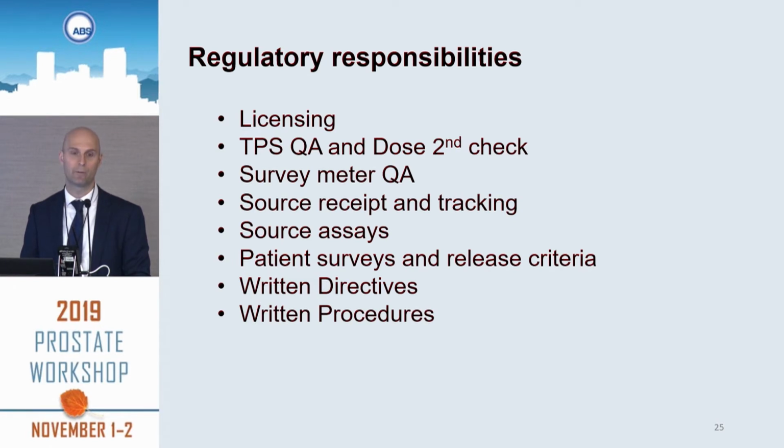You'll be responsible for having a survey meter that has been calibrated, and a process for receiving sources and tracking those sources, and the source assays. If you choose to do an assay, it is recommended by AAPM. There are requirements for what the technology specifications must meet, patient surveys and release criteria, and then of course written directives, what should be documented.